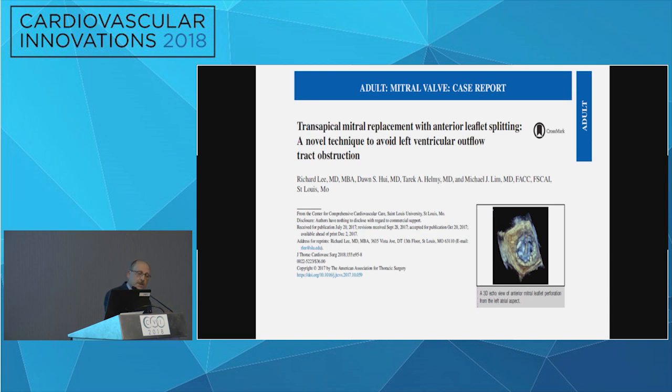potential complications. So if you have an anterior leaflet that is redundant and potentially would be pushed into the LVOT, using a LAMPOON or using the translocation technique may be of great benefit, especially if you're using a transapical approach, where this is fairly easy. And as we develop the transseptal approach, this would be one extra step, just penetrating the anterior leaflet and ballooning it. Then you deploy your valve as you usually do, and you really don't have to worry at all about any LVOT obstruction.